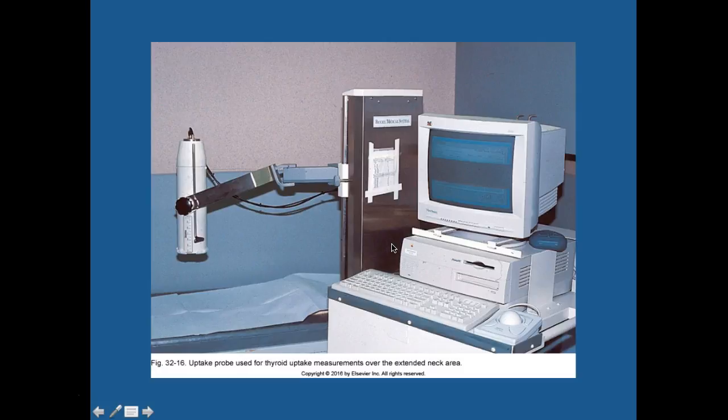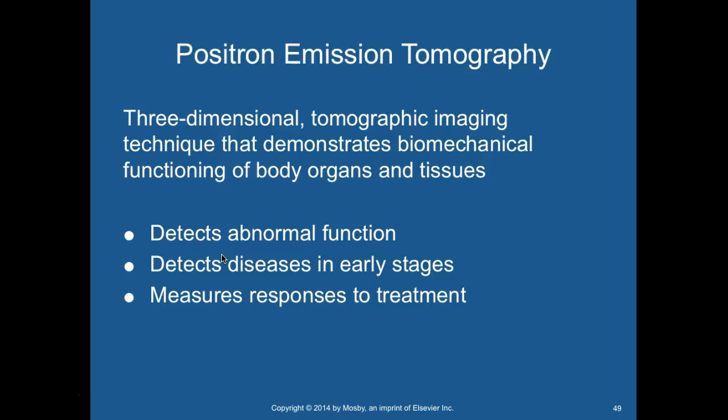This is a thyroid or an individual, like one area uptake. So it has just the one area that's going to uptake over a small area. Instead of using a huge gamma camera, you can just use this little one.